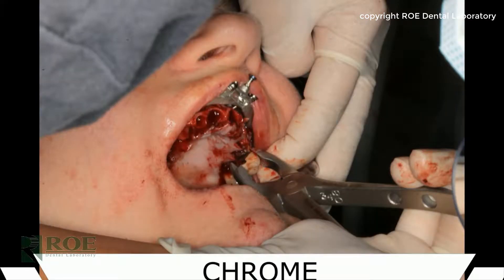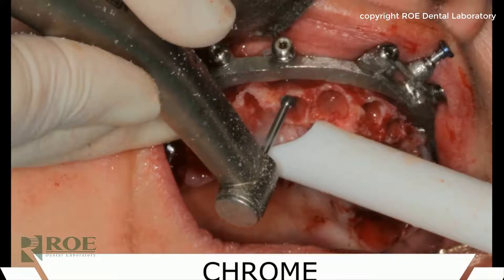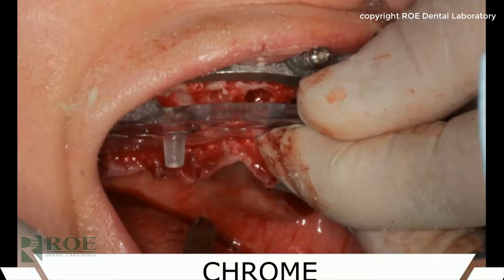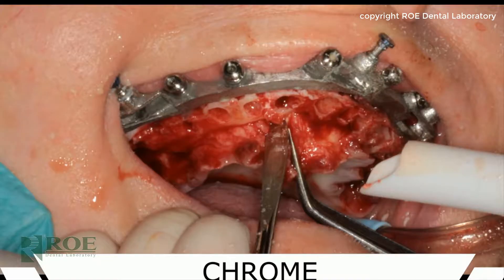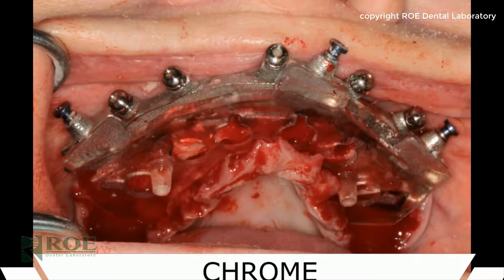With the fixation base seated, the remaining teeth are extracted and the bone is reduced down to a flat level even with the fixation base. You should be able to take a gloved finger and rub from the fixation base back to the bone and have a smooth transition. You can then try in the carrier guide to make sure no tissue or bone is holding it up.